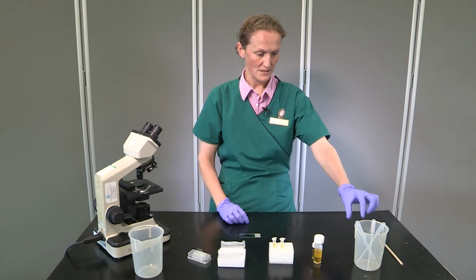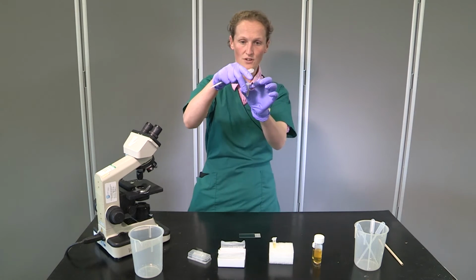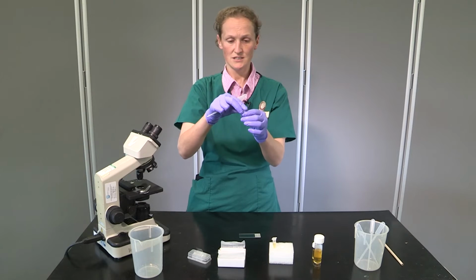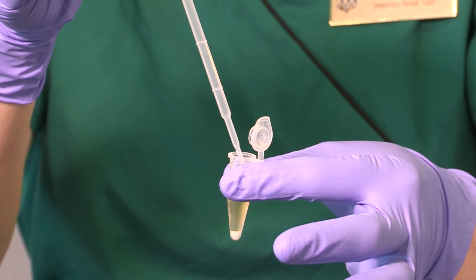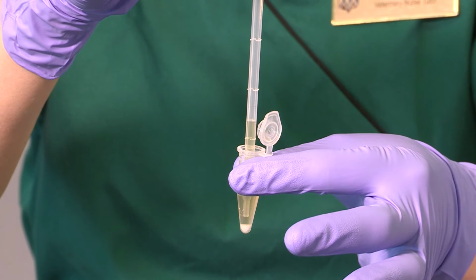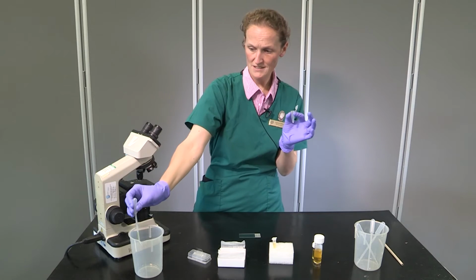So I'm going to take my clean pipette, take my urine sample, and if you look closely at it you can see that there's a bit of sediment in the bottom. So first step is to remove the excess with your clean pipette. Make sure you don't touch the sediment and remove as much of it as you can without disturbing it. Like so. Place that in the waste.